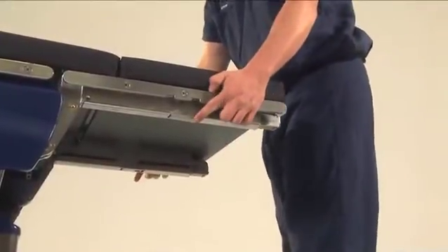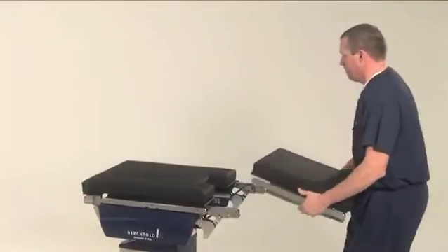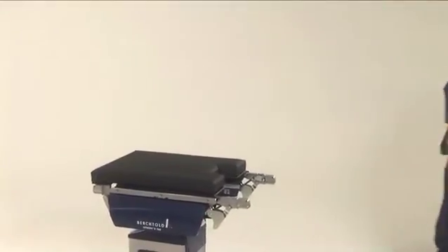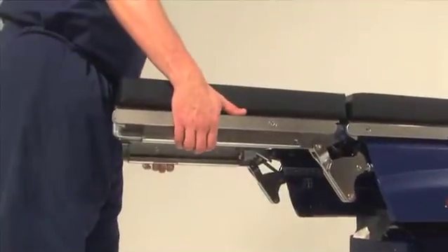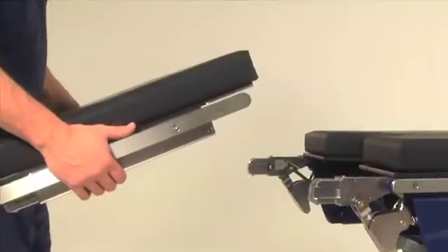To remove the back section, grasp the center of the section and press the lock release buttons, then pull the section away from the table. The leg section is removed in the same way. Be careful to balance the weight of the leg section so it doesn't tip downward when pulled from the rail system.